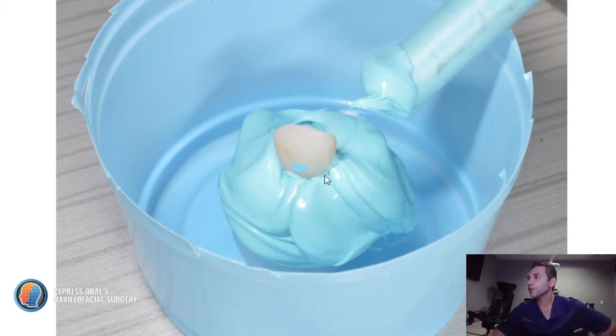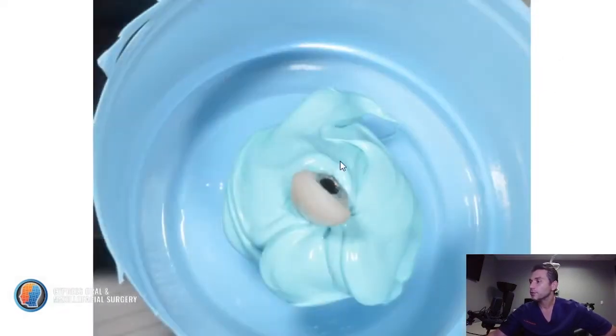And if you're patient enough, you can even use light body PVS. The impression is a lot more accurate. Here I used Blue Moose just because it's quick. It sets in about 30 seconds. But sometimes with the Blue Moose, what I notice is you get bubbles in there and it's just not very accurate. Here's a view from the top.